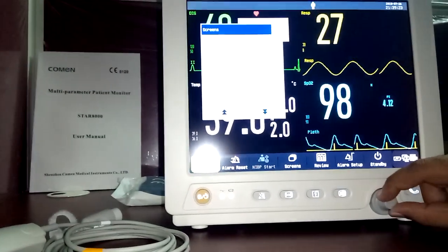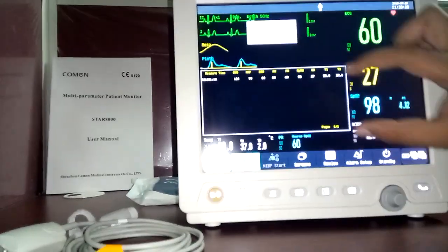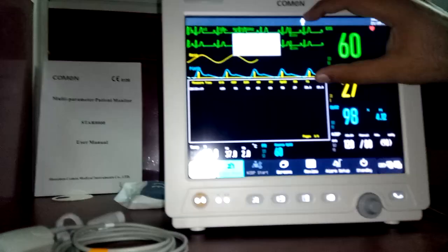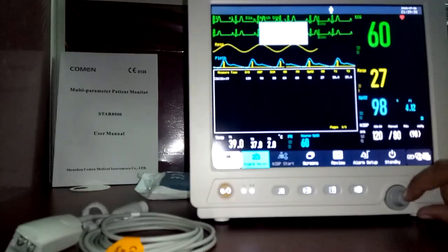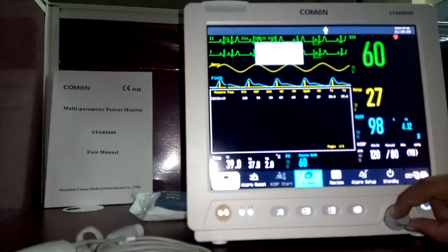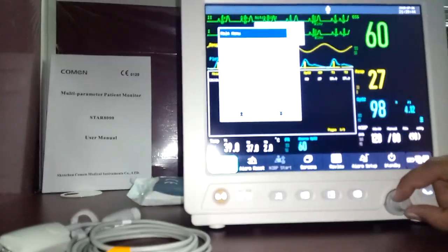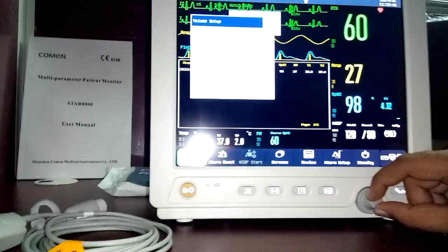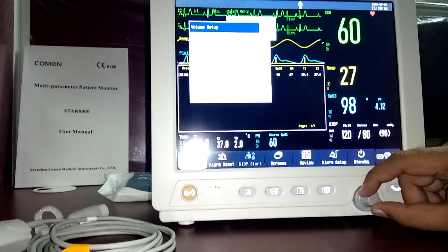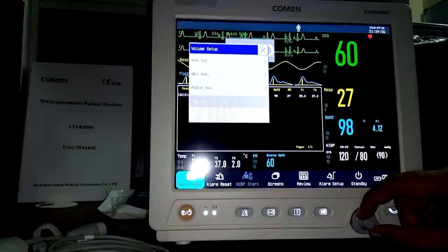The list screen displays all NIBP measurements along with other parameter history so you can review them at a glance. Under volume setup, you can configure alarm volume, QRS beep volume, pulse volume, and key volume independently.